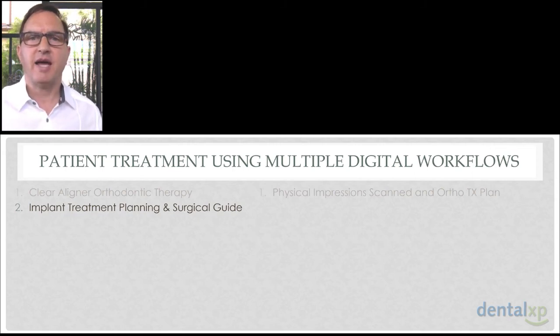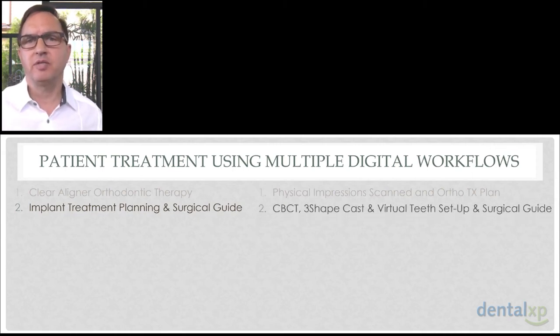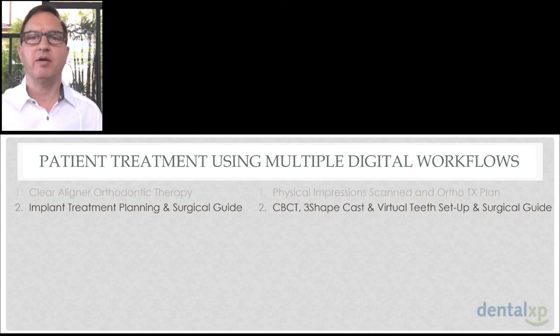And we accomplish that by achieving a cone beam CT of the patient. We take a physical impression of the patient's mouth and virtualize that with a 3Shape scanner. And then in the implant software, we merge those data sets, perform a virtual tooth setup, and order a surgical guide.